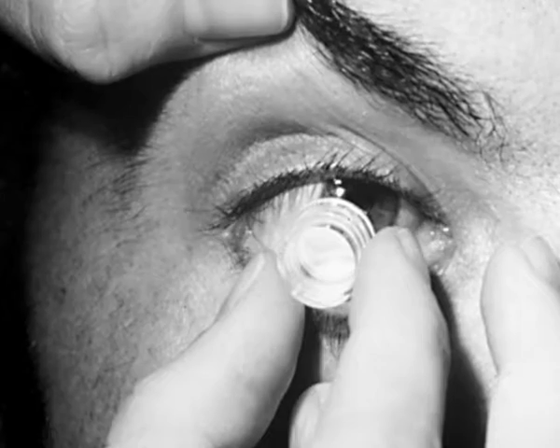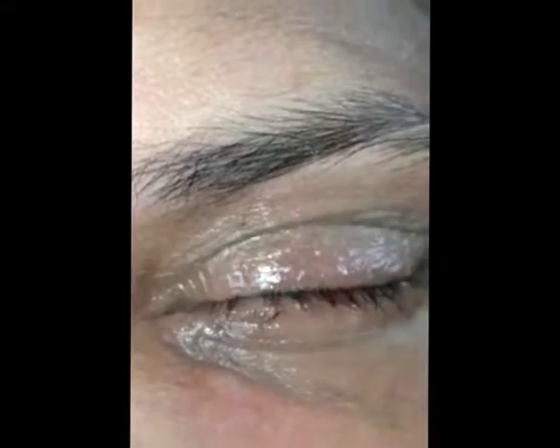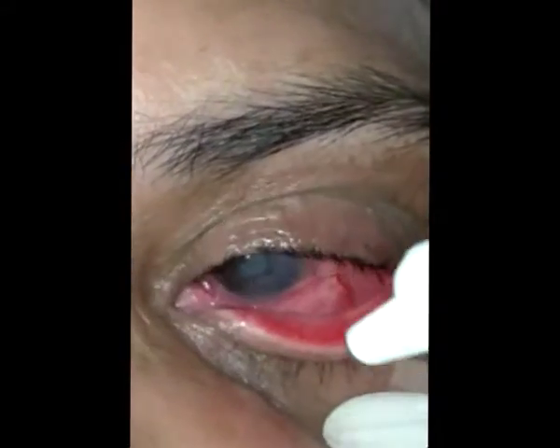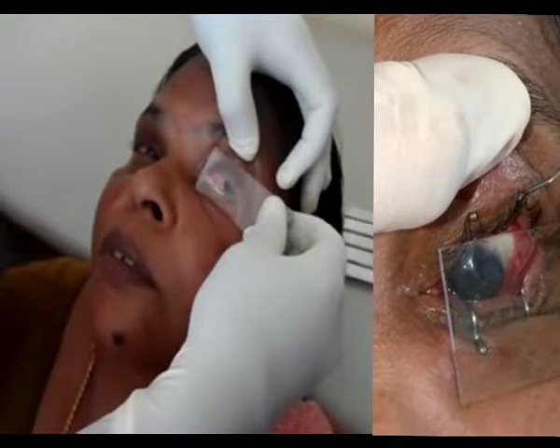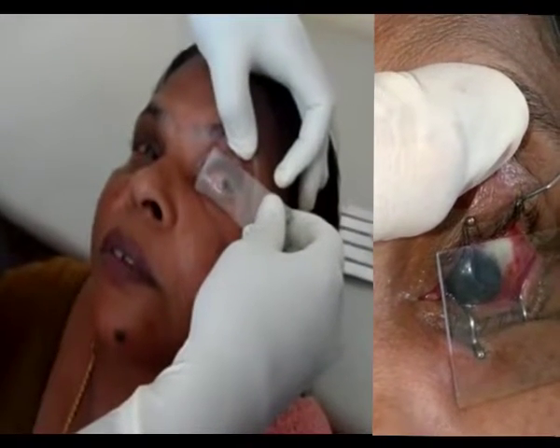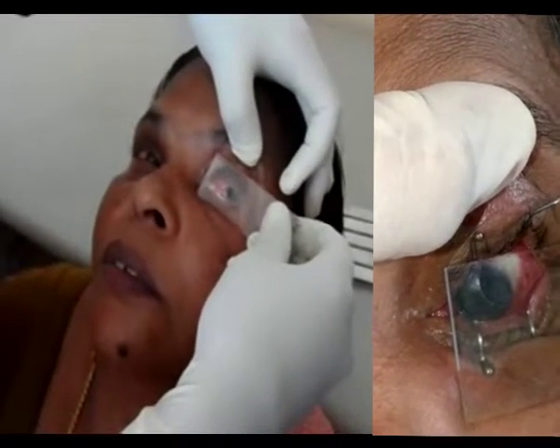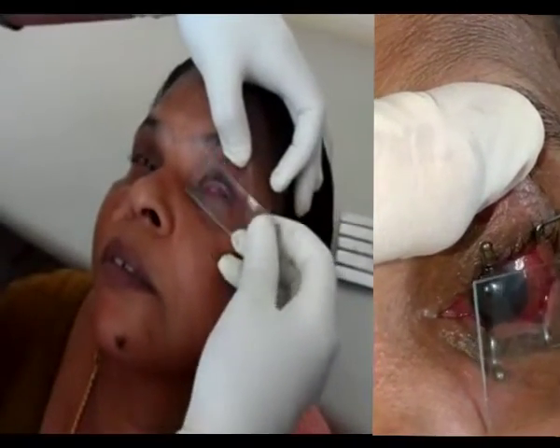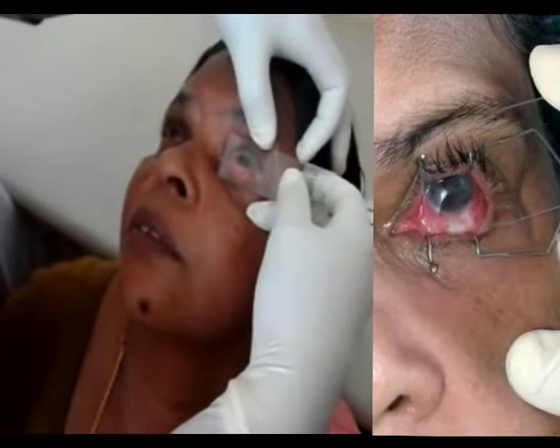So we modified the method. In our technique, the ocular surface is anesthetized with proparacaine drops. Plain glass slides are pressed against the suspicious areas for one minute. Different labeled slides are used for different areas.